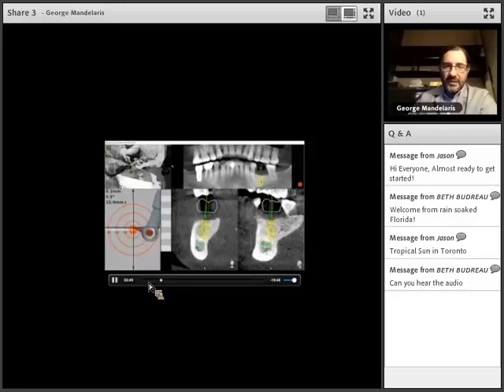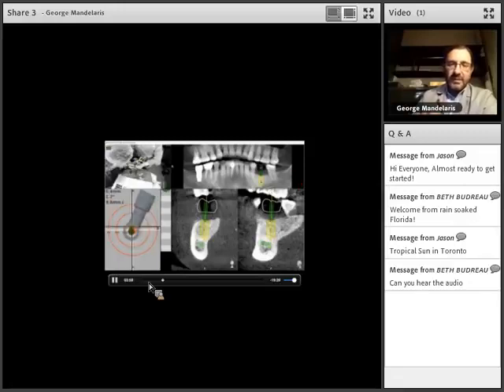So here we are from an entry point deviation. She's right on the money, and now she's just changing the angle deviation, so she's around 3 degrees, 2.5 degrees, 1 degree now, and she's placing an 11 millimeter implant, of which she has another 10.7 millimeters to go. So from here, it's just osteotomy site preparation, high irrigation, pumping the drill, and just watching what you're doing and being mindful and trying to make sure that we deliver the osteotomy site at the right entry point. We stay on target, entry point deviation, angle deviation, I should say, with our plan.